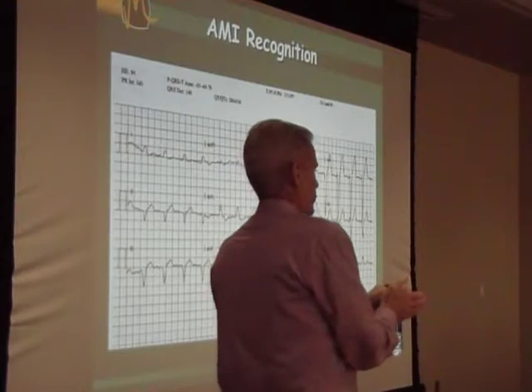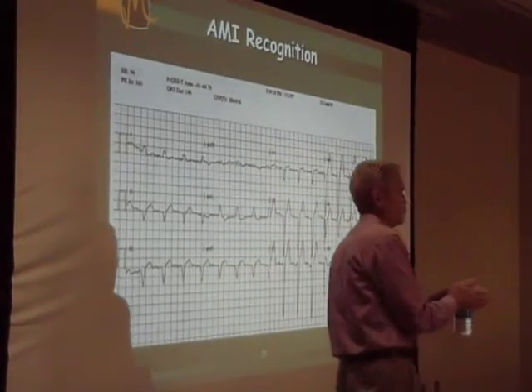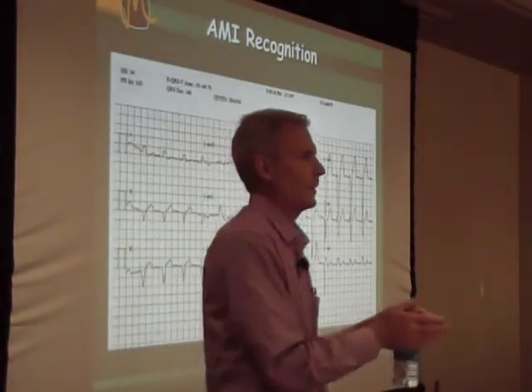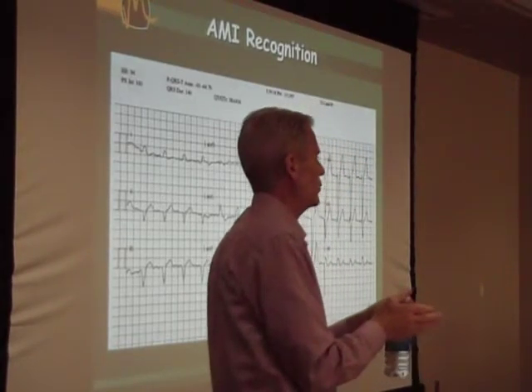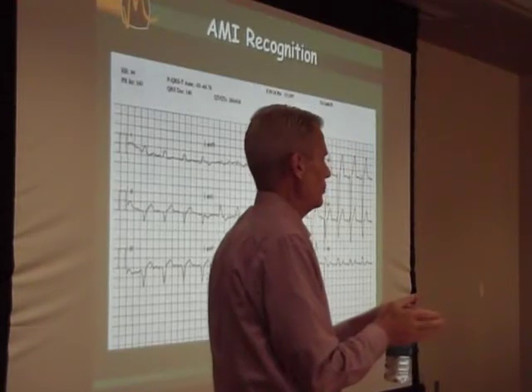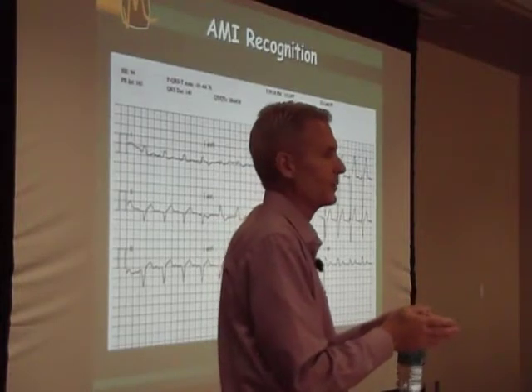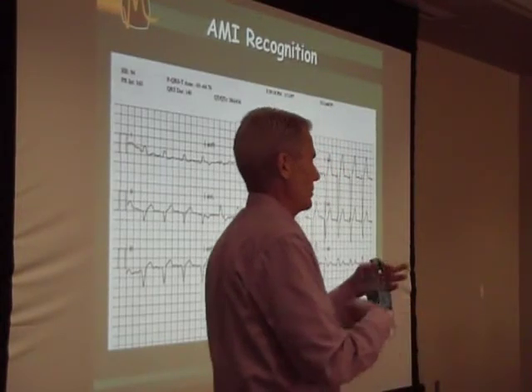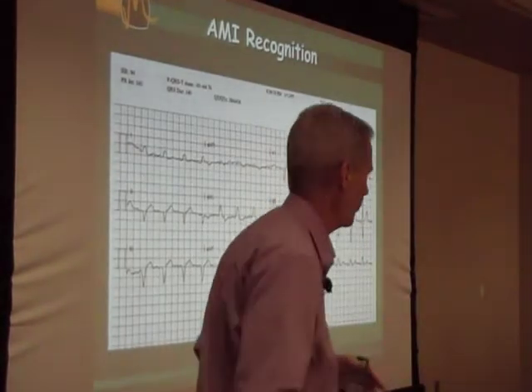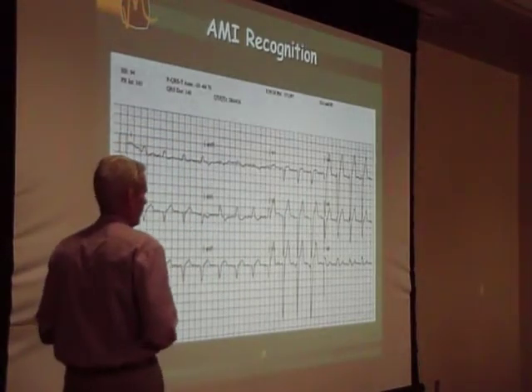As medics, as nurses, whatever field you're in for 12-lead interpretation, you have to know those other issues. And when we get to the last module of today, we're going to talk about the infarct mimickers. And we're going to share with you a process for figuring out what that is. And it takes going over that information repeatedly to kind of get it centered in your brain and utilize that during patient assessment and therapy.